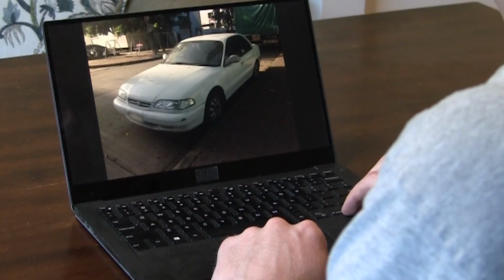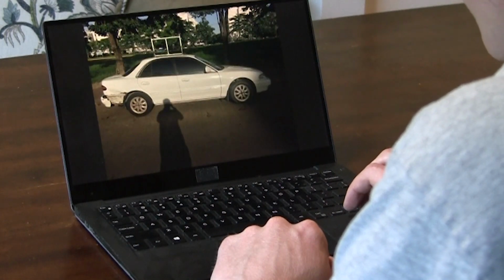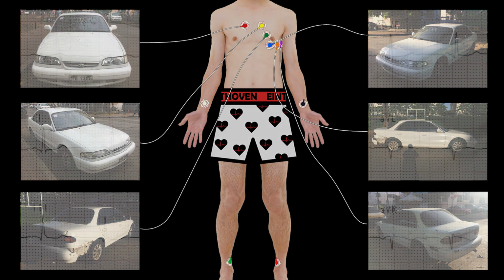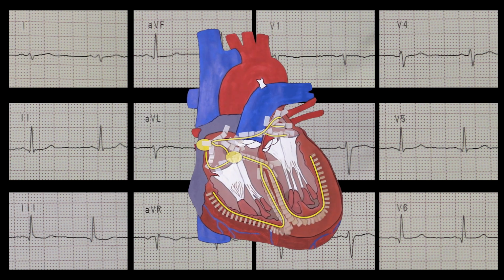With multiple pictures taken from different points of view, we get a better idea of what condition the car is in. Ooh! Wow, look at that bumper. There's quite a bit of damage there we couldn't see from the other angles. Each lead on our EKG is like a different picture of the car. If we only look at the car or the heart from one angle, we don't get the full picture. However, if we look from multiple angles, we might notice damage we couldn't see before. The 12 leads on our EKG give us a more complete representation of heart conduction.